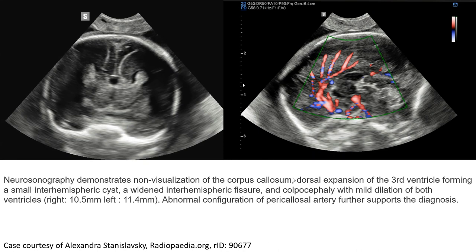This is the case of a prenatal cranial ultrasound. There is non-visualization of the corpus callosum, and also expansion of the third ventricle. A small inter-hemispheric cyst and a widened inter-hemispheric fissure are noted. Colpocephaly is present, with mild dilation of both ventricles. Abnormal configuration of the pericollosal structures further supports the diagnosis.